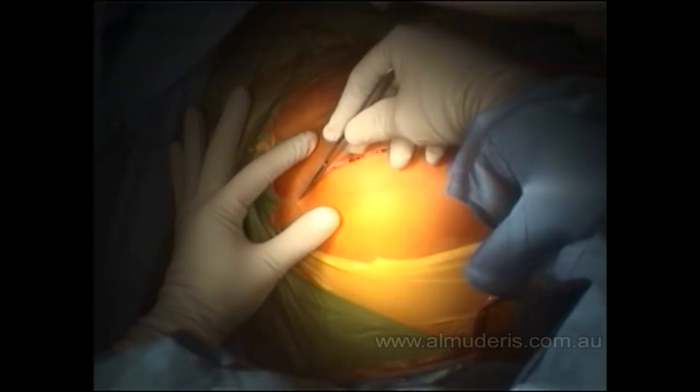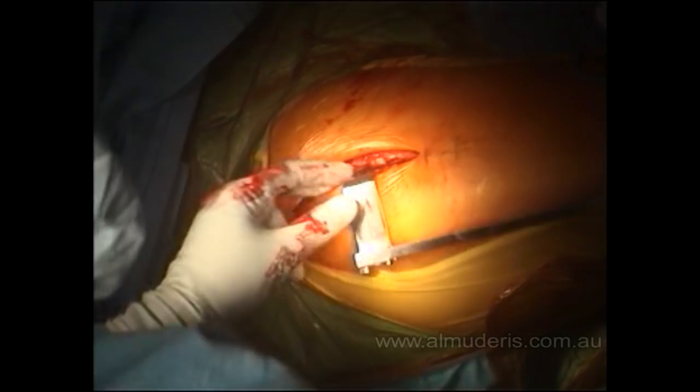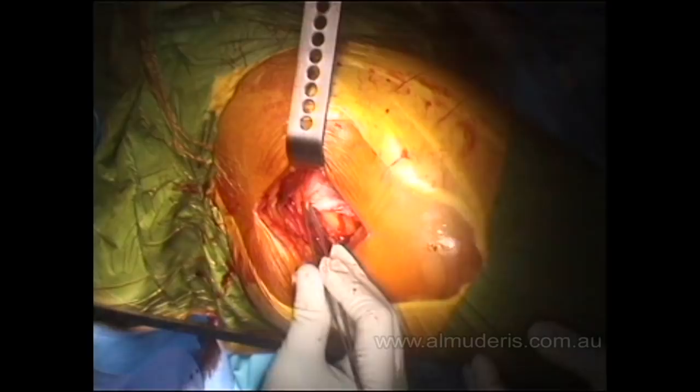The incision is made in a curvilinear shape along the fibers of the gluteus muscle, incising the skin, subcutaneous tissue, and the gluteus muscle. A self-retainer is then inserted. After exploring the wound, you reach the bursa.